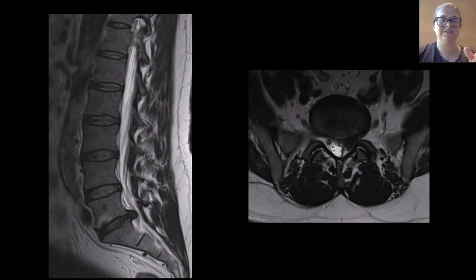Before we move on, in terms of how to formulate or review a report, I will tell you how I formulate mine, and then you can decide whether you like that and what you're doing with other radiologists. So typically what I do is I give them a count. If I have previous images, I'm looking at them. A lot of these patients will have previous radiographs and CTs, and that's really helpful.